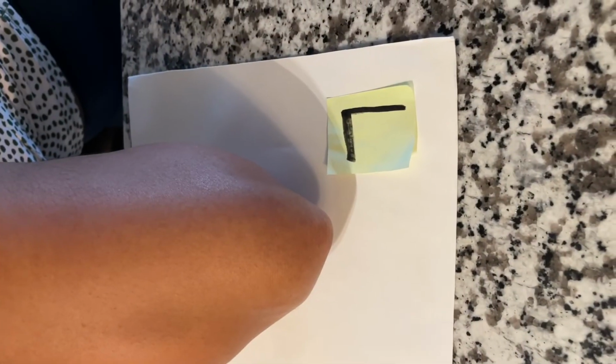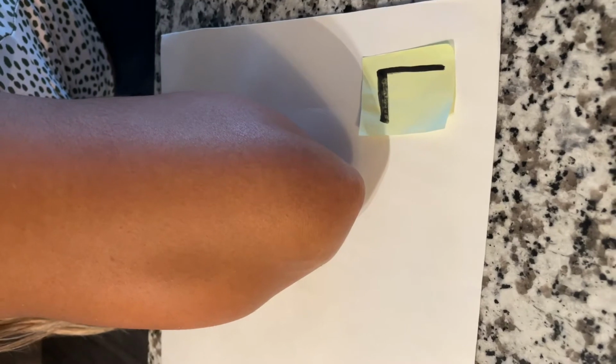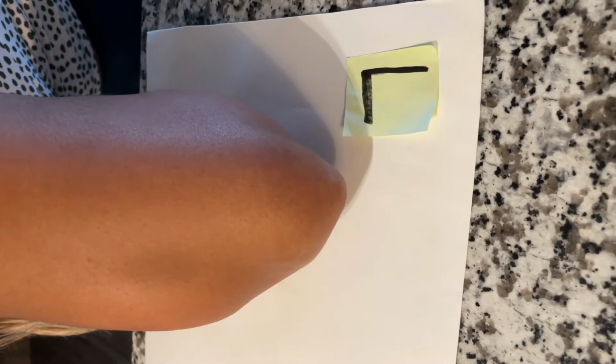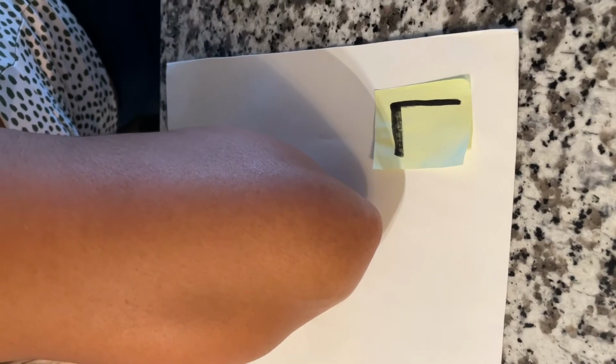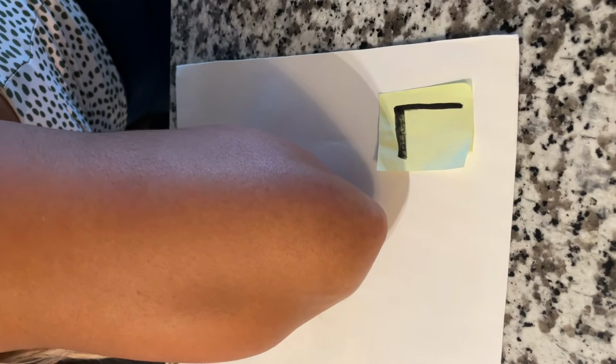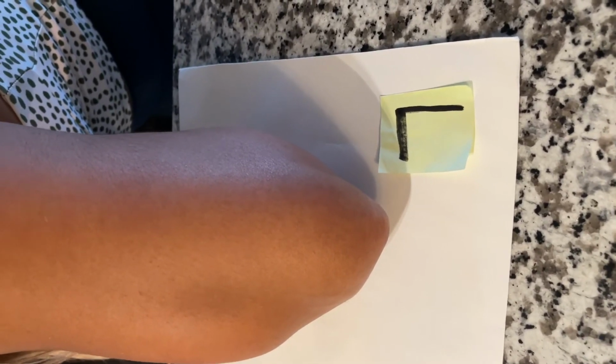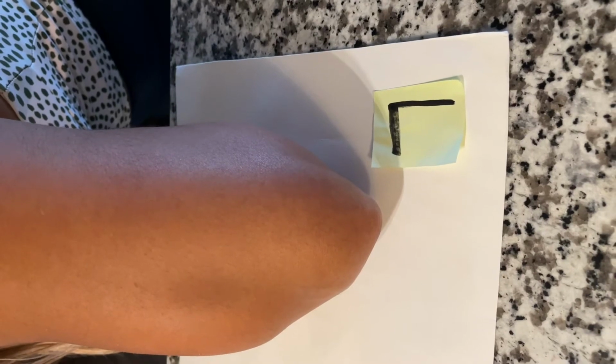For the elbow acute flexion position and ulnar sulcus, we're going to have the patient seated with the elbow flexed and the forearm resting on the image receptor. The central ray will be perpendicular to the humerus, approximately 2 inches superior to the olecranon process, through the center of the film receptor space.